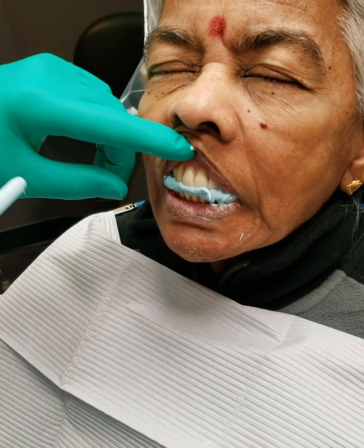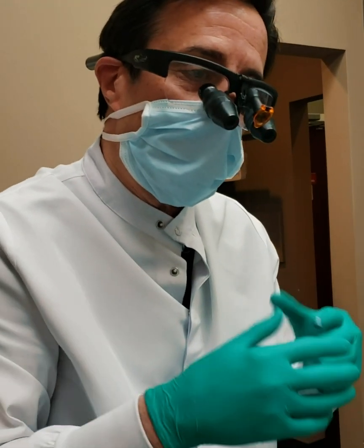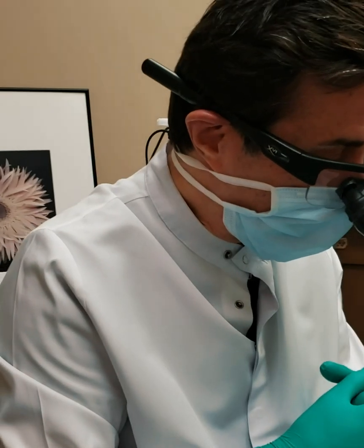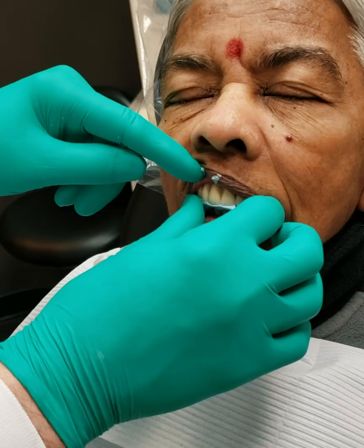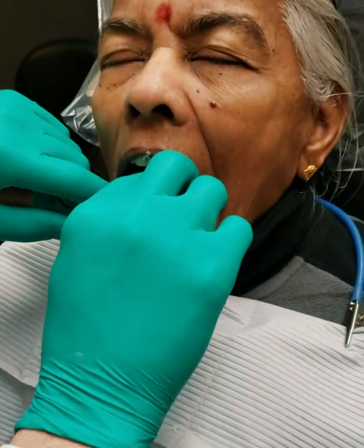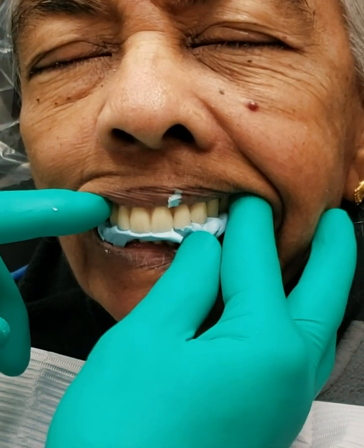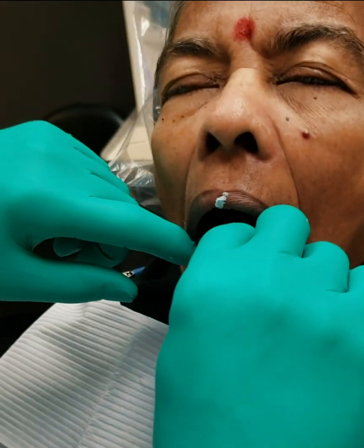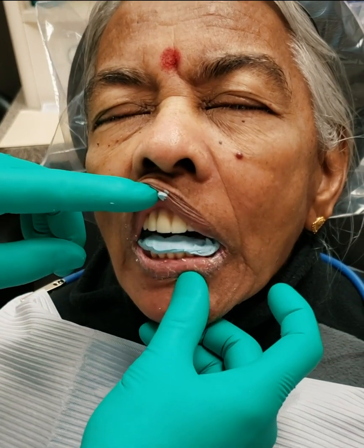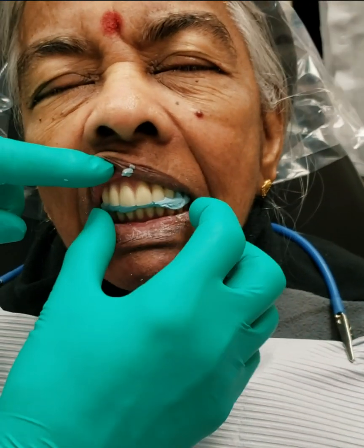Close down, please. Now you always ask the patient to close down, not to bite down. If you tell them to bite down, they tend to posture anteriorly. So this is just closed down, and she's doing it wonderfully. Okay, open please. Good. Now again, I'll reinsert it. Close down. Good. Open. Okay. One more time. Close down. Okay. Open, please.